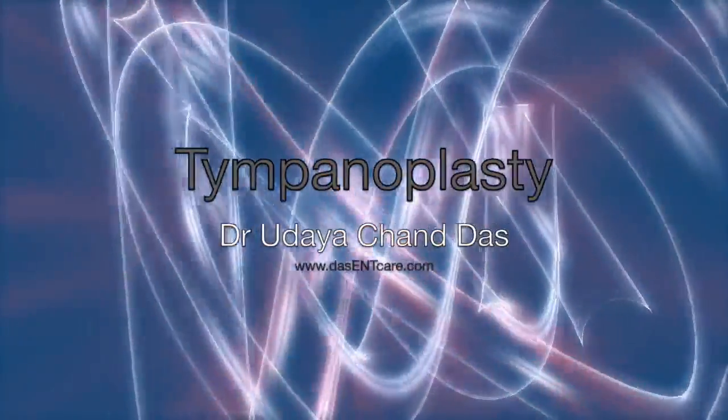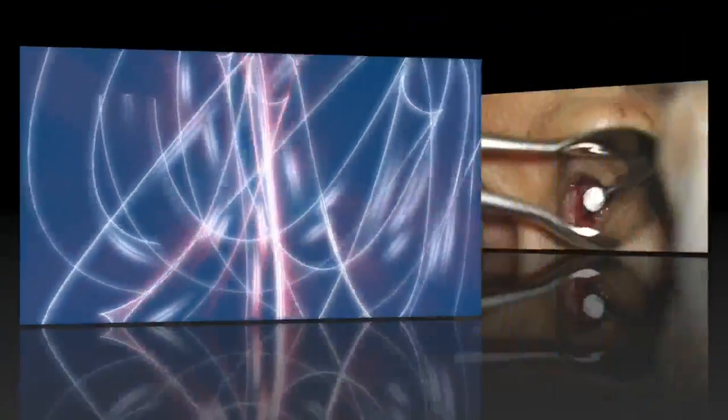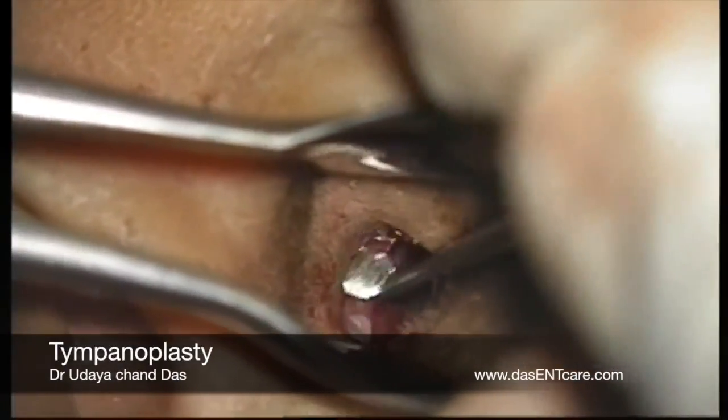Hi, this is Dr. Das here. I am presenting a video of Tympanoplasty. Tympanoplasty is a surgery to repair a perforation in the eardrum, at the same time inspecting the middle ear structures.